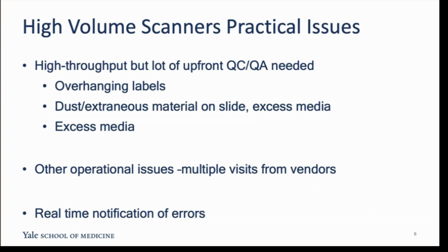We live in a world, I think, where we are used to buying very high-end electronic equipment, and we just plug and play. You do an initial setup, and then you're good to go. Obviously, digital scanners don't fall into that category. There is an initial heavy lift where they have to be installed within the hospital firewall. They have to be hooked up to the image server and so on. And once that was done, we went through a phase where we had to do a lot of troubleshooting.